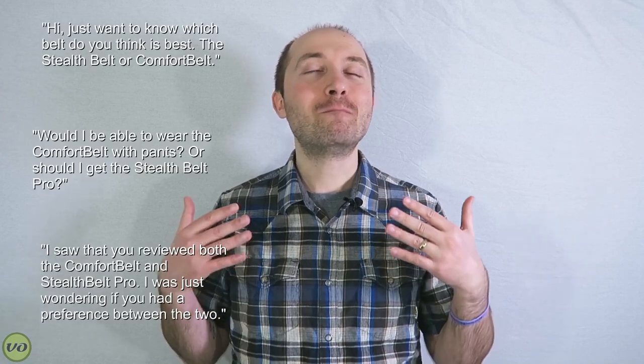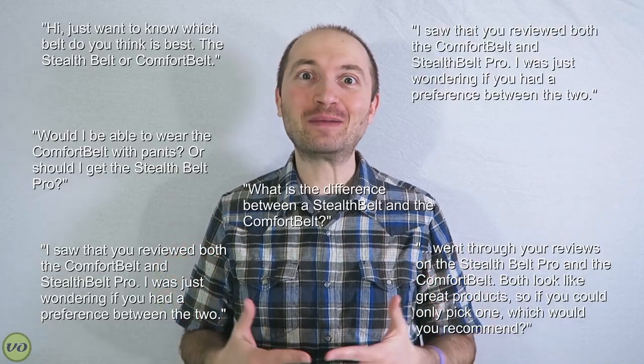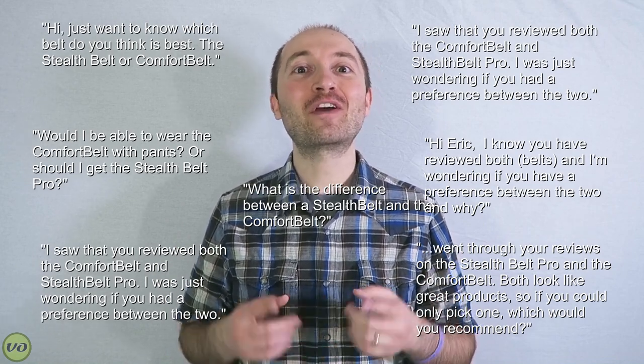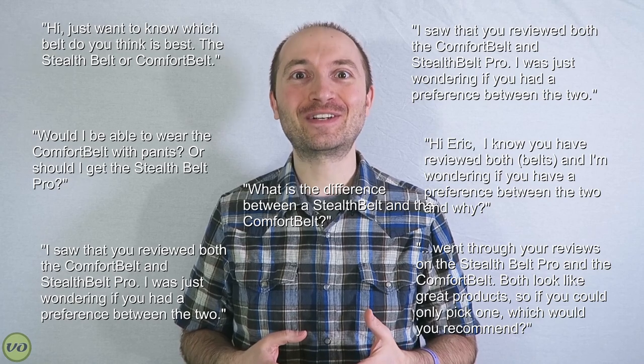Hey guys, it's Eric. Today I'm going to be bringing you a very special showdown between two really popular accessory belts for ostomates. This video has been requested many, many, many times, so I really appreciate your patience. Stay tuned — we have the Stealth Belt versus the Comfort Belt. Let's get started.